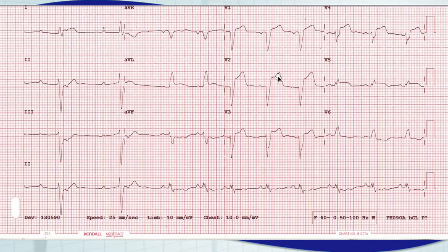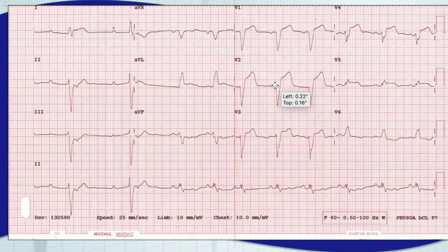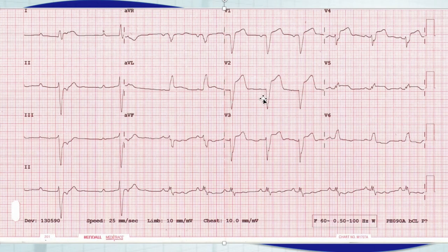But if you don't have that and you're looking for discordant ST segment elevation, now instead of counting to make sure it's 5 millimeters, what he does is it's proportionate. For it to be excessive ST elevation, you can have over 5 millimeters of ST elevation and not have an MI if you have a very deep QRS complex. Well, that discordance may be proportionate, so it might not actually be indicative of an MI. What he says is if the actual ST segment elevation is 25% the size of the preceding S wave, then it's more indicative, and he has a very high sensitivity for this, of a myocardial infarction. So 25%, that would be a quarter.